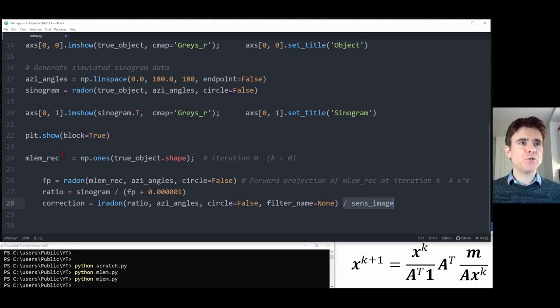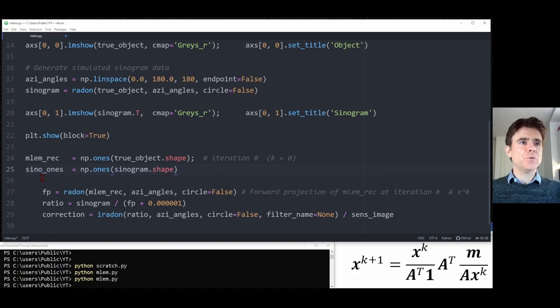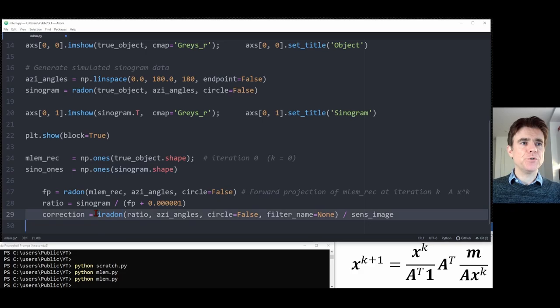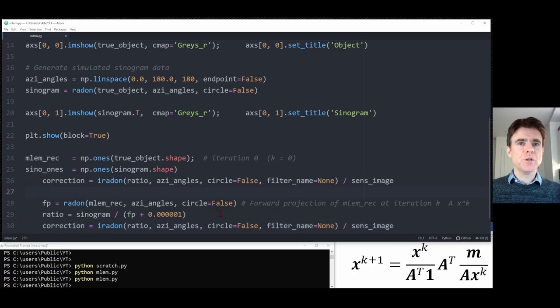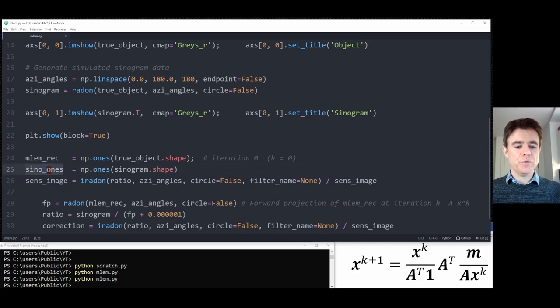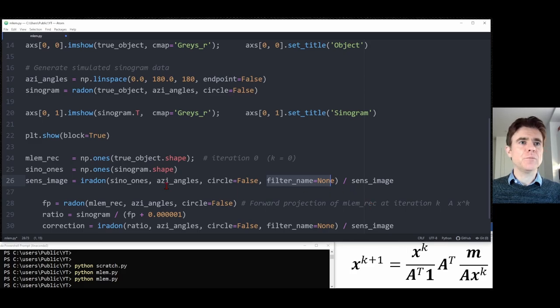We call A-transpose-1 the sensitivity image. We need to define that before the reconstruction loop. To compute the back projection of ones, we create a sinogram filled with ones — the same shape as the true sinogram — and then back project it using iradon with no filter over all azimuthal viewing angles, considering the whole square. That gives us the sensitivity image.